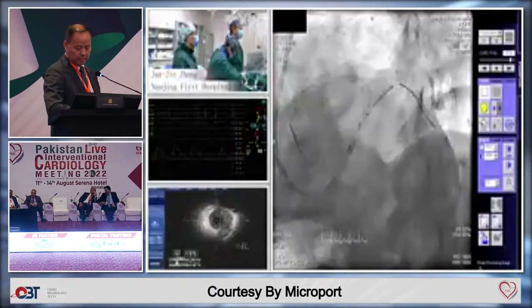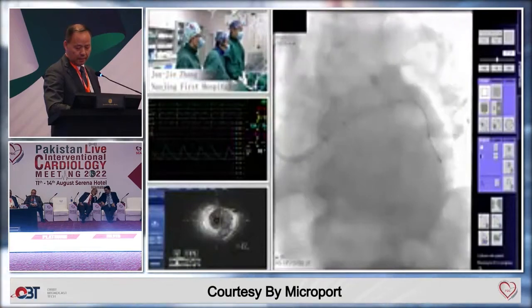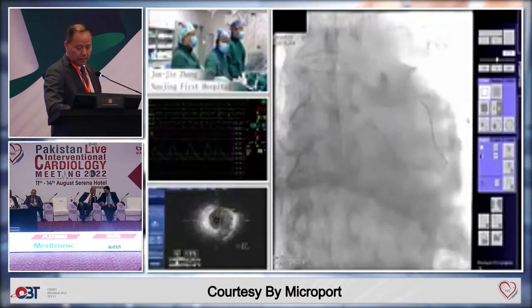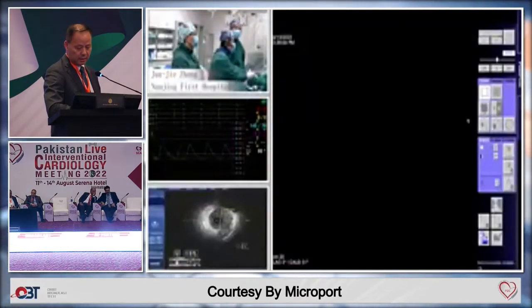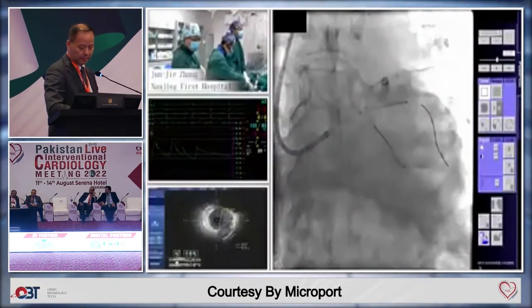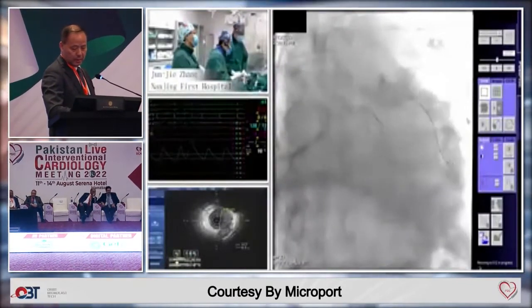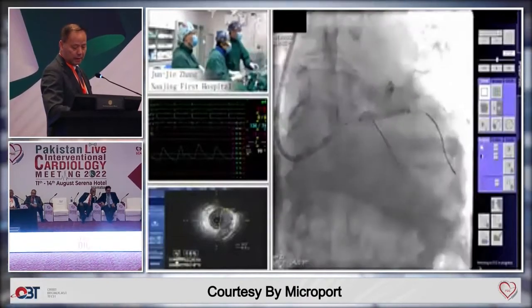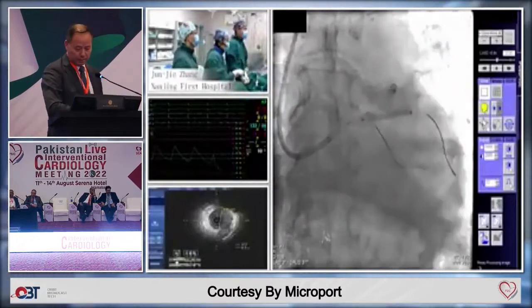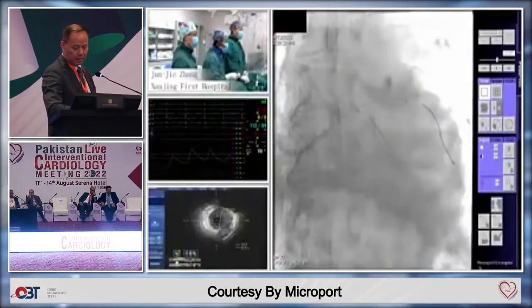AP caudal. Okay, we can hear you. There is clearly no signal. We lose the signal. Yeah, can you hear us? Can you hear me? Jun-Jie, why didn't you choose to go into the native circ rather than the OM? Was that because of the angle? Yeah, now this is 2.75. Yeah, now no connection, no audio. Jun-Jie, can you hear me? Yeah, we just lost the signal. Now I can hear you clearly.